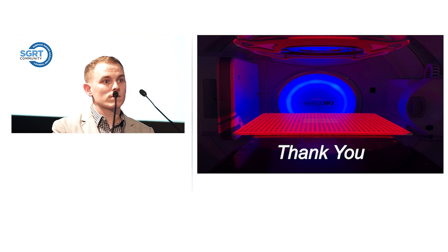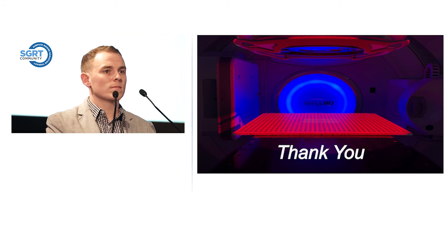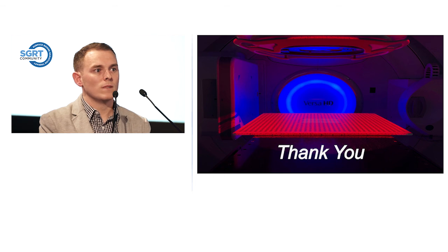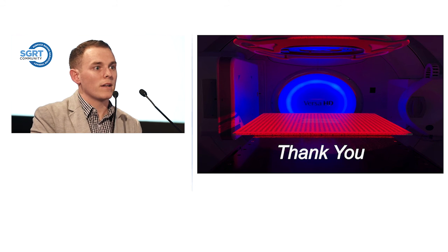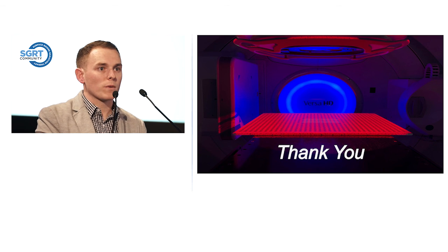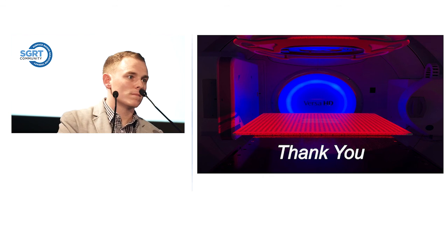Hi, thank you for a really good talk. I do apologise if I missed this. Just regarding your DIBH patients for breast treatments, with planning CT, do you have a free breathing CT and a breath hold CT in order to do the matching? Yes, we do. So you set the patient up again using the free breathing CT and the breath hold. We don't think it's a problem taking 2 scans because the free breathing scan is a fallback option. Okay, thank you.